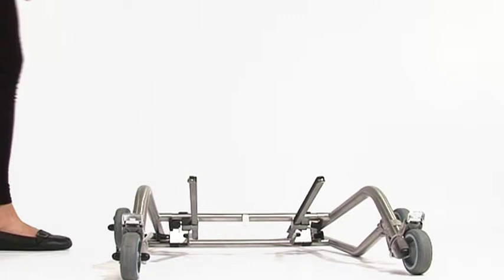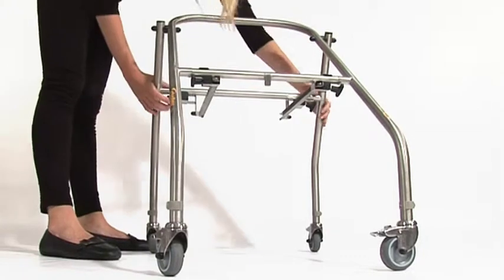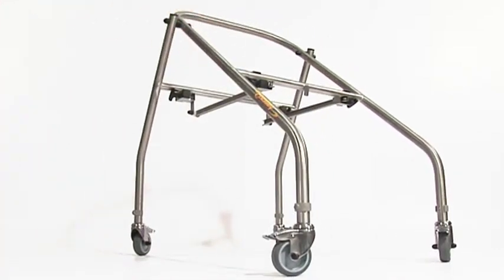To erect the mobile frame, hold the frame by the back legs, allowing the front legs to swing open. Open the frame to its full extent and release the spring plungers, ensuring that they are fully engaged into the locating holes.